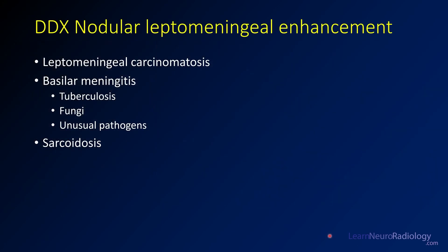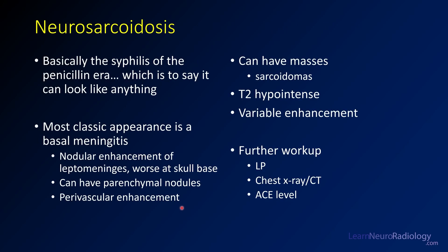For nodular leptomeningeal enhancement, the three main differential considerations are: leptomeningeal metastatic disease or carcinomatosis; meningitis or infectious process (usually unusual pathogens like tuberculosis or fungal disease); and sarcoidosis. This is a case of sarcoidosis, which is like syphilis in that it can look like many different things and have many manifestations.